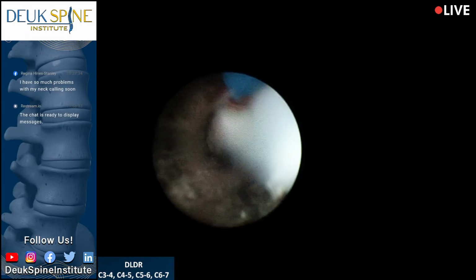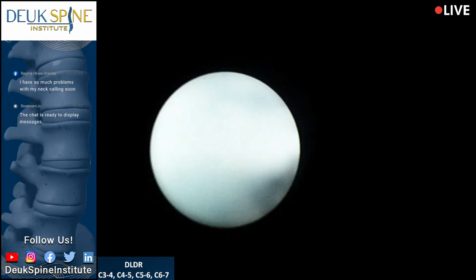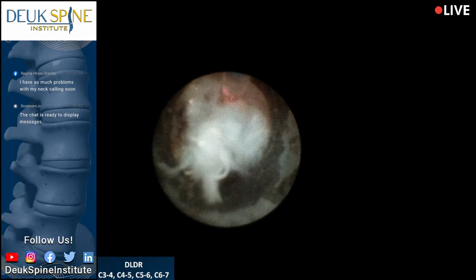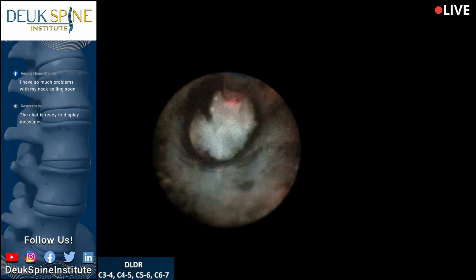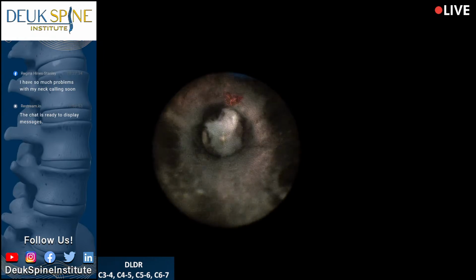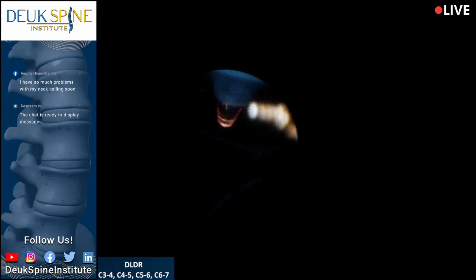More herniated disc, degenerated disc coming out. Just about done here with this one. Let's see if I can float it. I'm gonna have to grab it out. Scope on, please. Thank you.